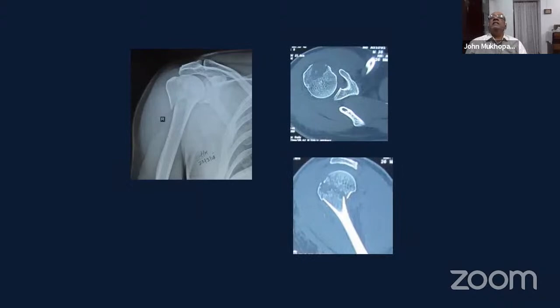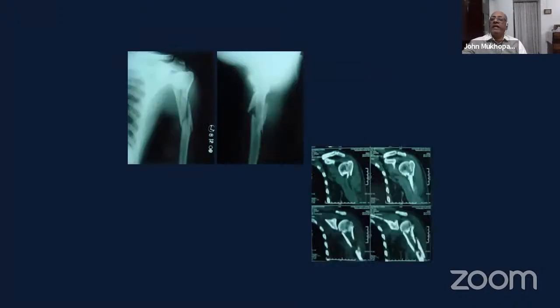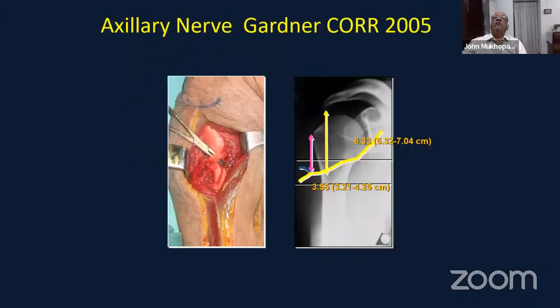So this would be the classical type of case where the greater tuberosity is slightly displaced. You can see the fracture extends onto the neck, or this sort of situation where there's an extension with comminution onto the shaft of the fracture. Remember, you have to go under the axillary nerve.